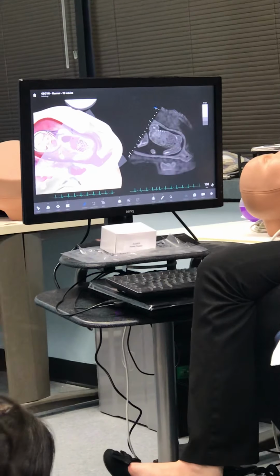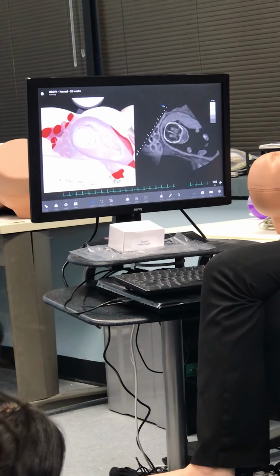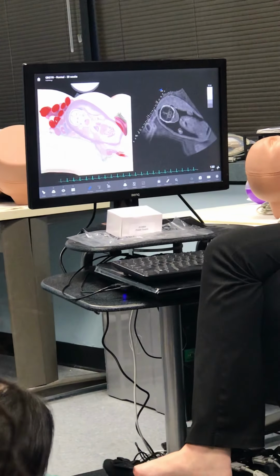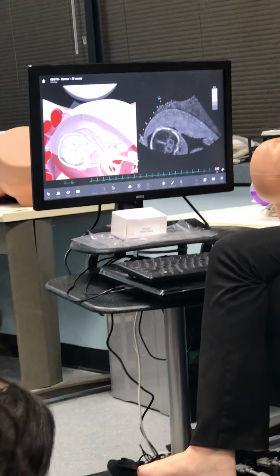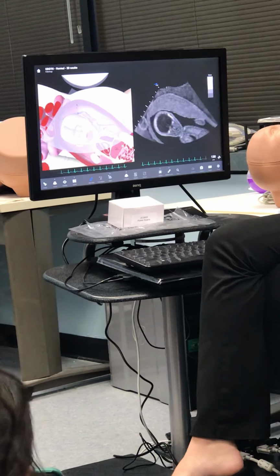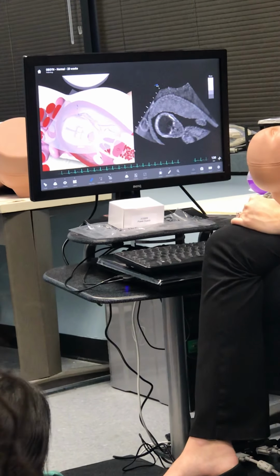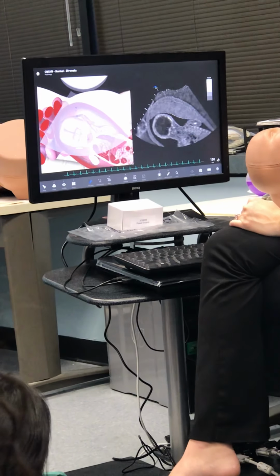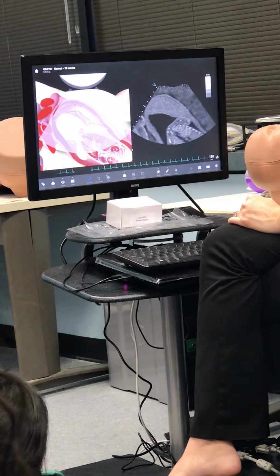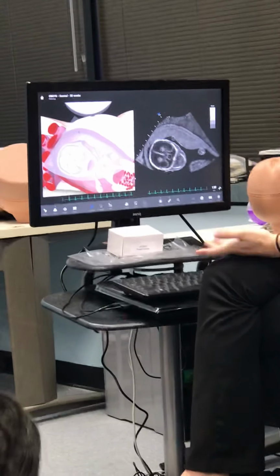Okay. So then the other thing that I wanted to talk about was placenta. So placenta is, how do you? Oh, you're zooming with the scroll. With the scrolly, yeah. Okay. So placenta, honestly, this is kind of what placentas look like. See how it's like a nice, smooth, echogenic blob thing? That's my placenta.